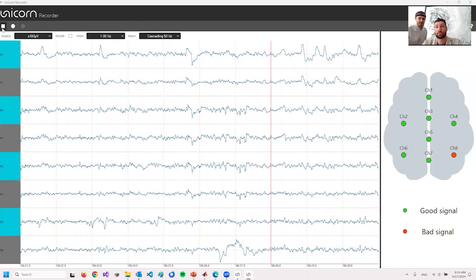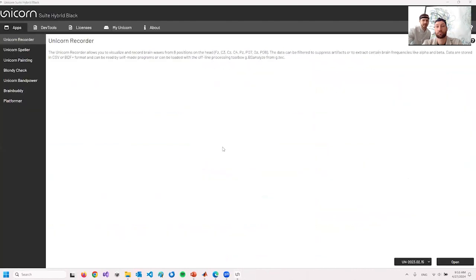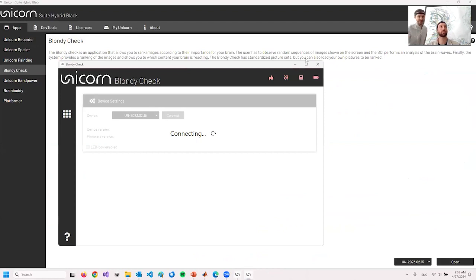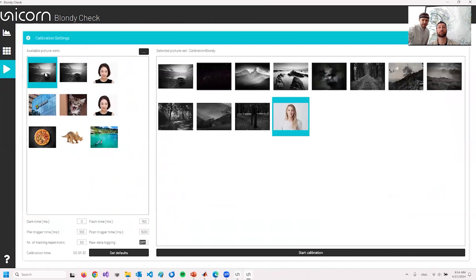with some BCI experiment. First, I'd like to show you the Blondie check, which is a P300 application that I showed before in the slides. This is the image ranking application. It measures the P300s, and we can test if we can get some good P300 signals. You can see the paradigm here. We have 2, 3, 4, 8, 11 non-target images, which are just grayscale images, and 1 image with a blonde lady. We expect this blonde lady to trigger attention in Leo's brain, and we can follow if the system can detect it.